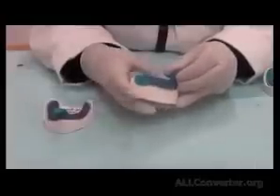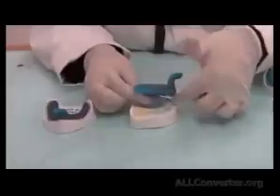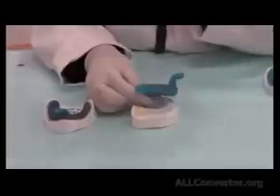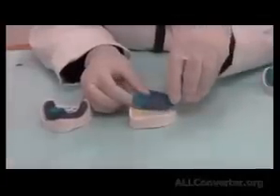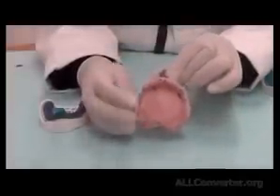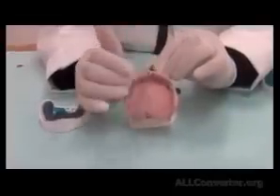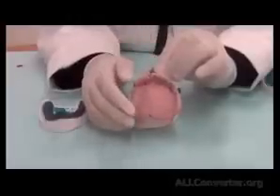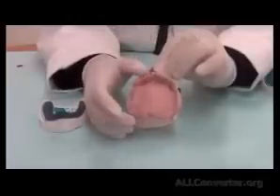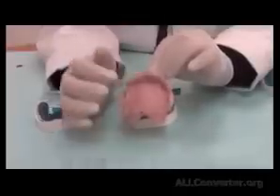For the secondary impression to be done accurately, we try to concentrate on the borders first, and we take an impression of the borders only, and we call that border molding. And then we flow our zinc oxide eugenol over all of the border molding, and we do the secondary impression. So we have accurate reproduction of the borders first, and then we flow the impression material over the whole fitting surface or the basal seat area on the tissue and the fitting surface of the tray. So once we squeeze, we get all of the basal seat details of the soft tissue. So it's a two-step stage. Border molding first, and then over it we take impressions.